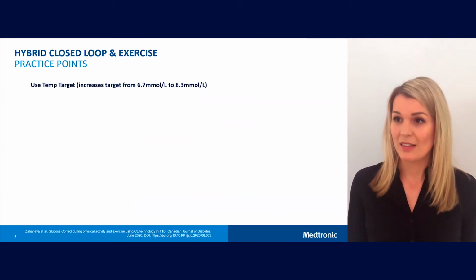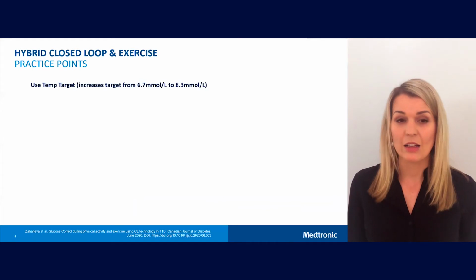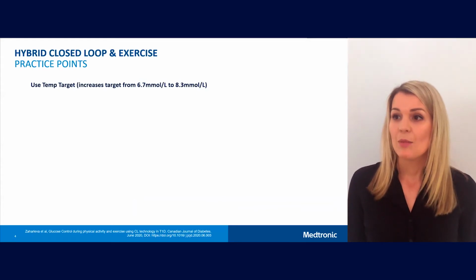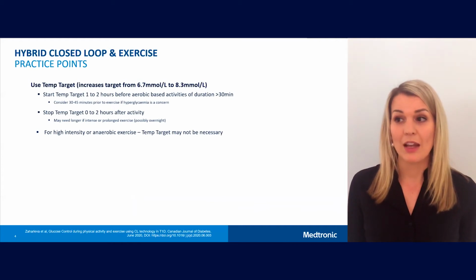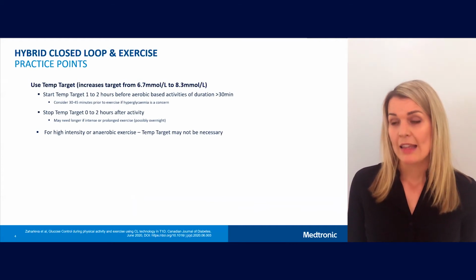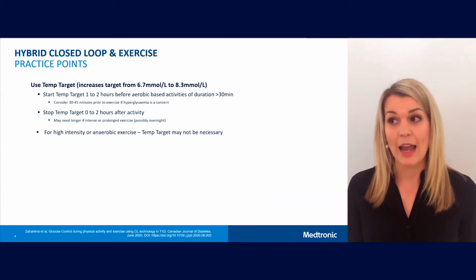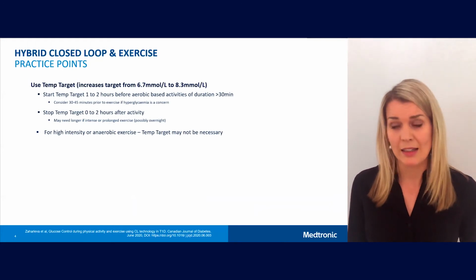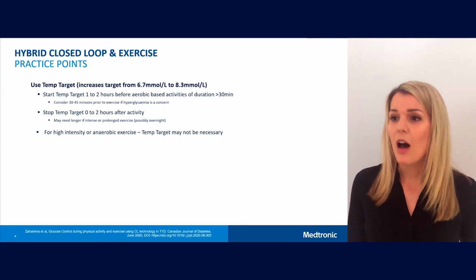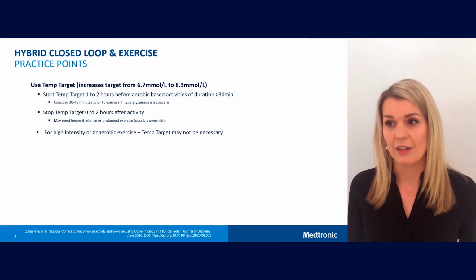So in summary, for the 670G, for activity that can cause hypoglycemia, set a temp target 1 to 2 hours before the activity until 0 to 2 hours after the activity. The temp target increases the auto-basal target from 6.7 to 8.3 and can be used in any situation where hypoglycemia is an issue. For high intensity or anaerobic exercise, a temp target may not be necessary.